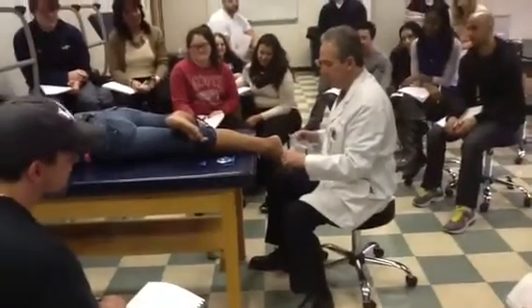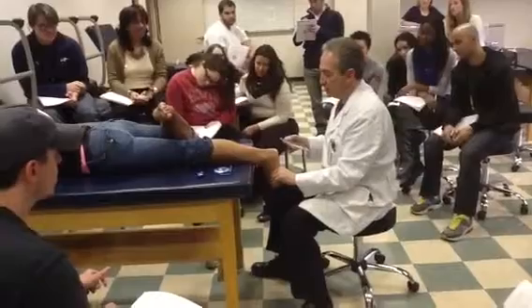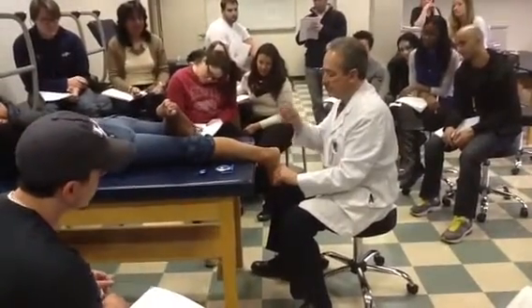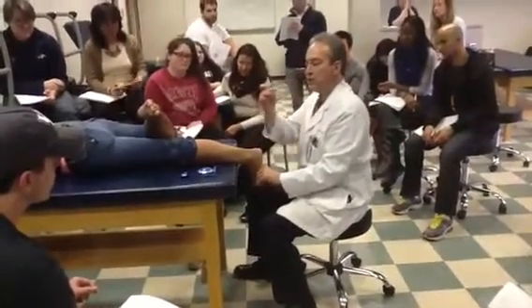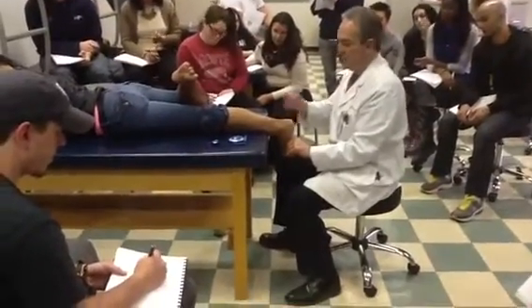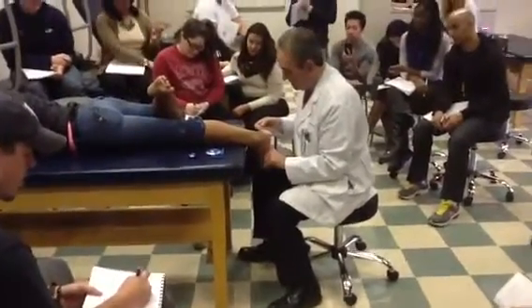All right, so I'm going to load the forefoot again, put the subtalar joint neutral. Using my other hand, I'm going to show you 2 ways to use the OED to measure this. All right, 1, you can take the OED, and what you can do is line up the etched perpendicular line here with your calcaneal bisection. That automatically creates a perpendicular with the other etched line down here at the bottom. Okay?